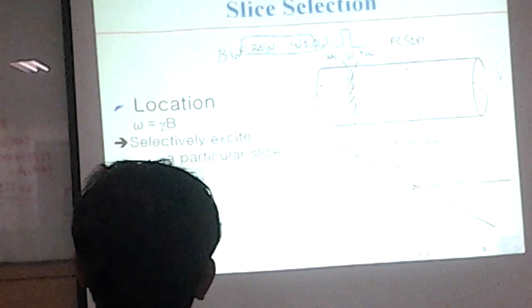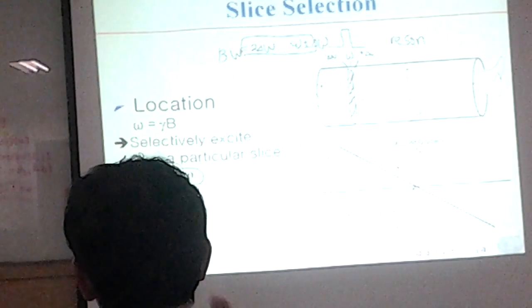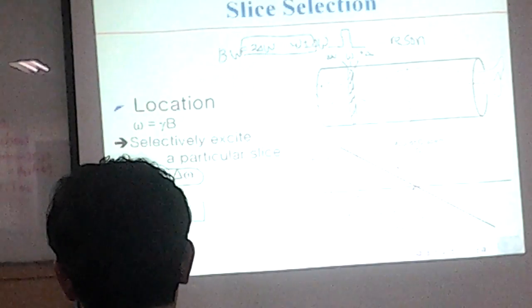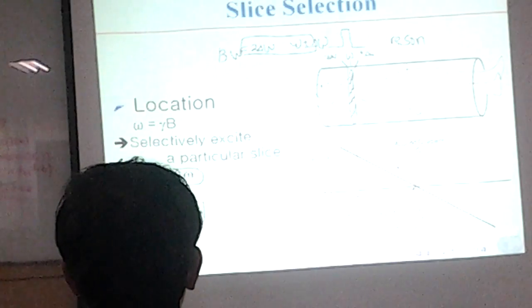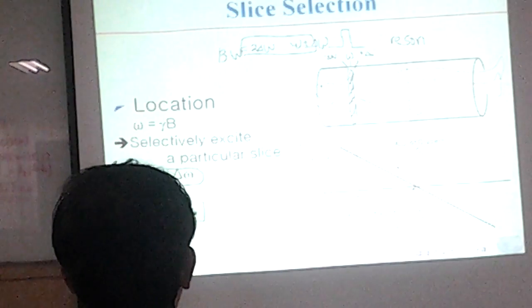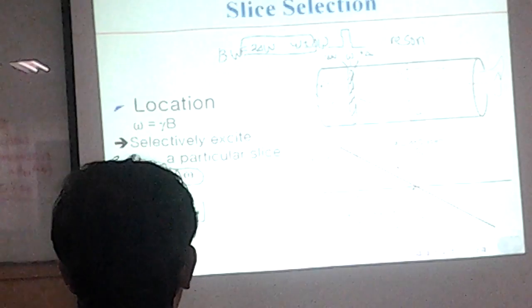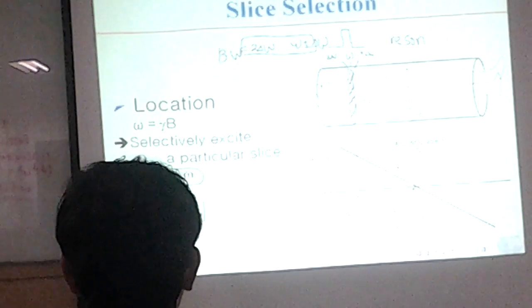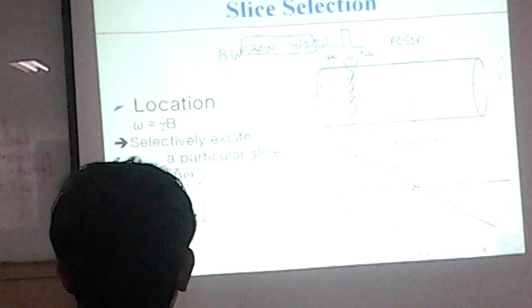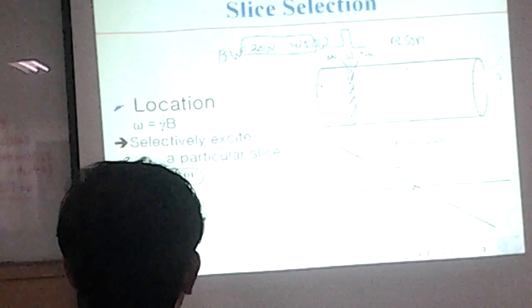For the external energy with the same frequency can transfer the energy to the spins maximally according to the resonance phenomena. So that's why MRI has the R letter, which is designated by resonance.